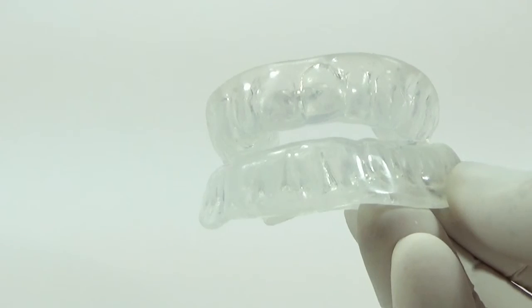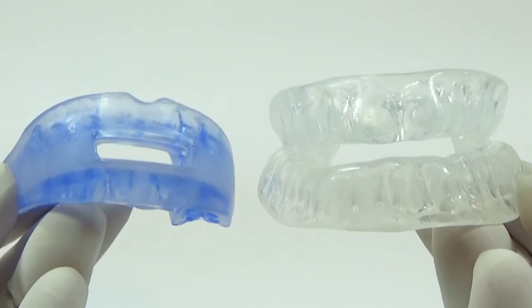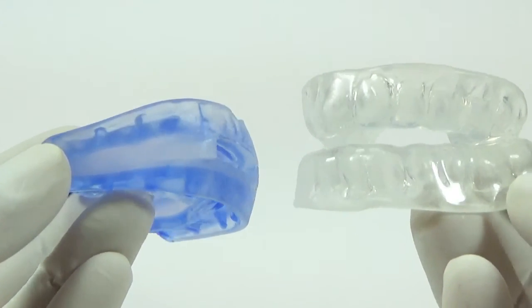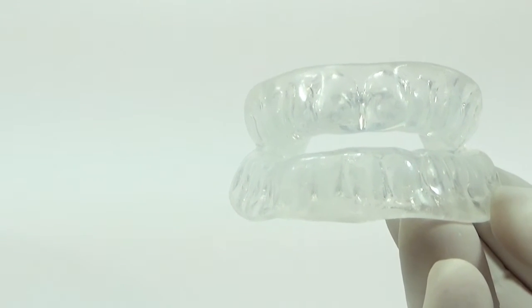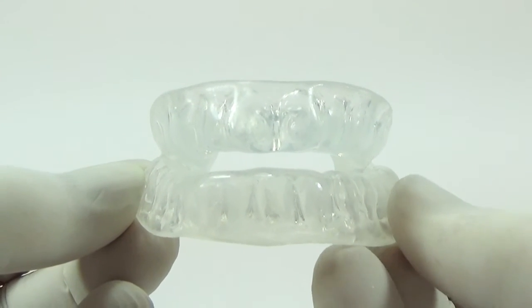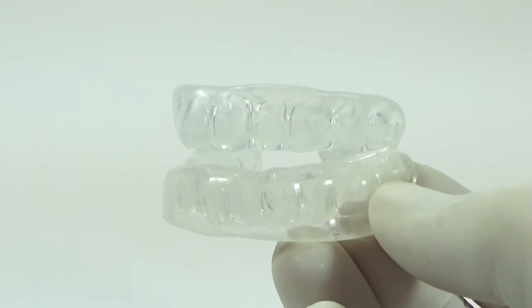It's significantly cheaper than having a dentally fitted device and significantly more comfortable than the Sleep Pro Sleep Tight. This really is the Rolls-Royce of devices and is recommended by the NHS as the first-line treatment option for those suffering from mild to moderate sleep apnea.